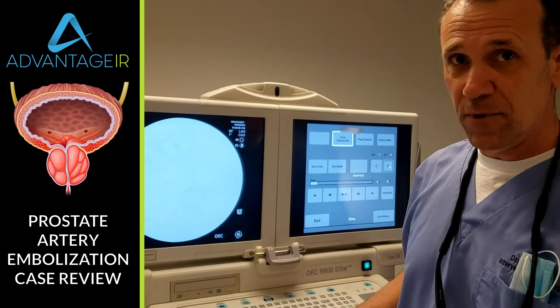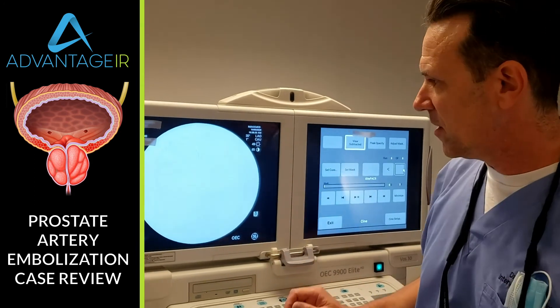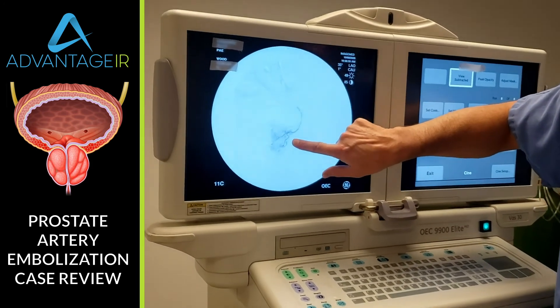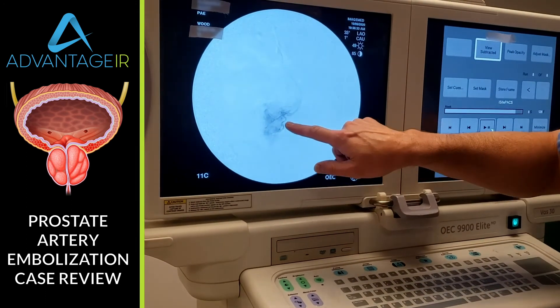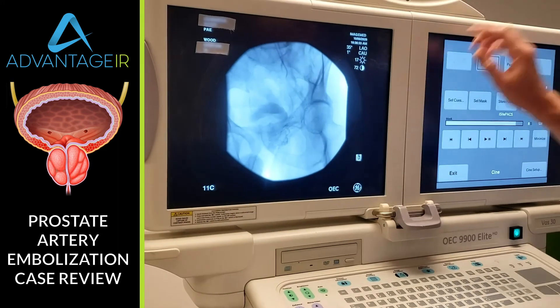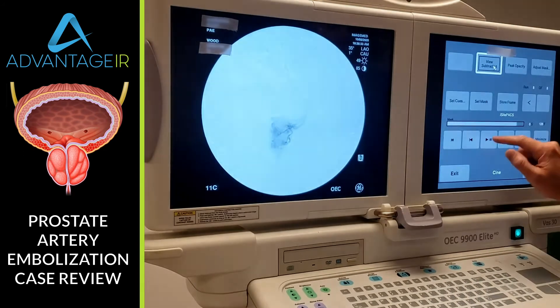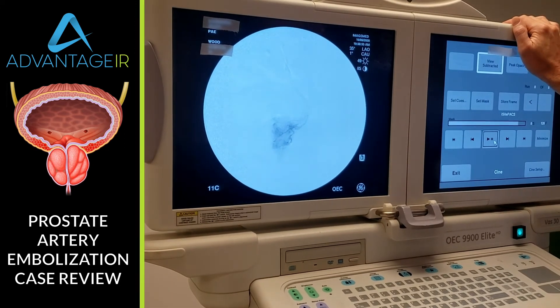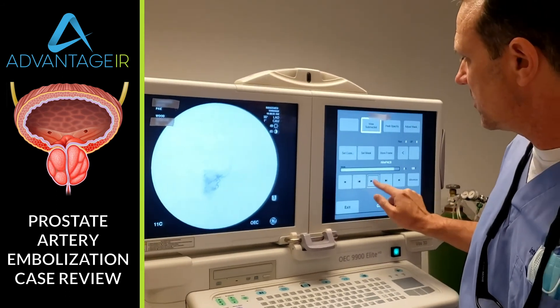We're going to go into that with the microcatheter, and that's what we've done here. After giving nitroglycerin, we've got a better angiogram. We're injecting in the left prostatic artery, and you can see the blush — the capillary phase blush in the prostate tissue right there. Let's bring the bones in — yes, an ideal location for the prostate. We gave the beads and closed up all those branches into the prostate.